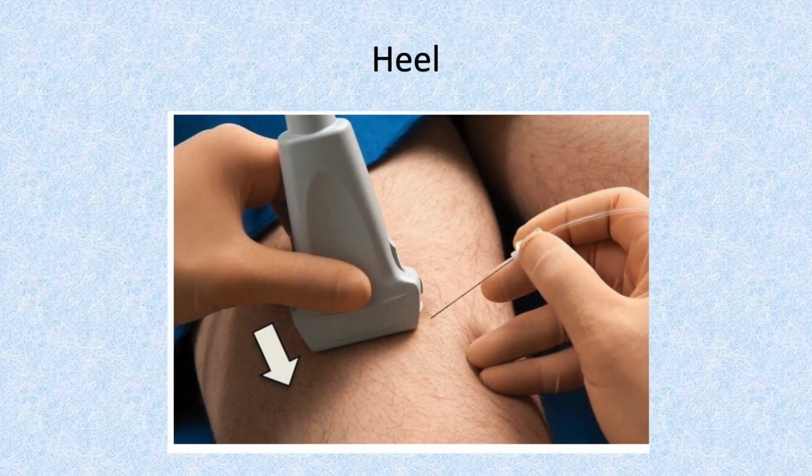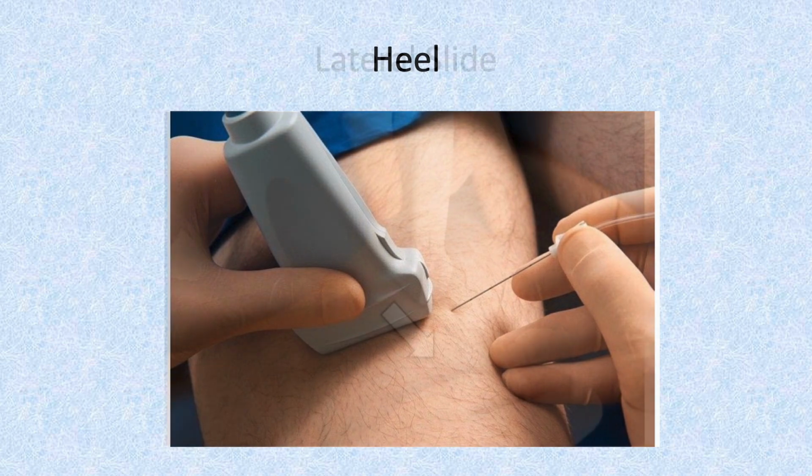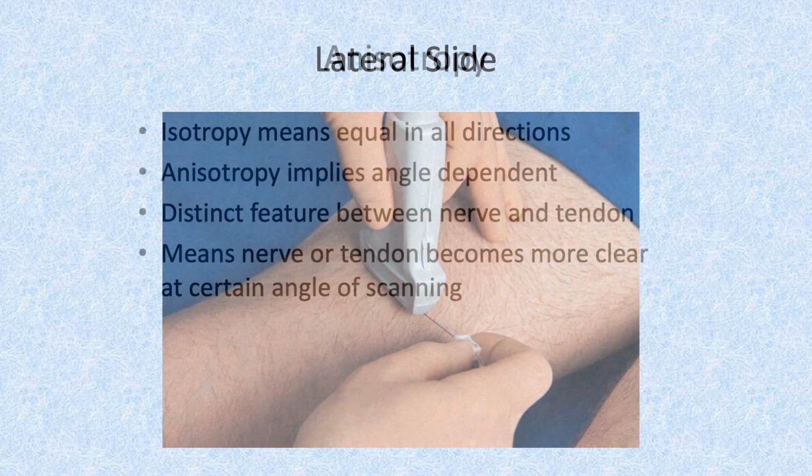You put your transducer lower, closer to your needle. Make it more superficial, make it more flat. Lateral slide, you want to slide your transducer nearer to your needle.